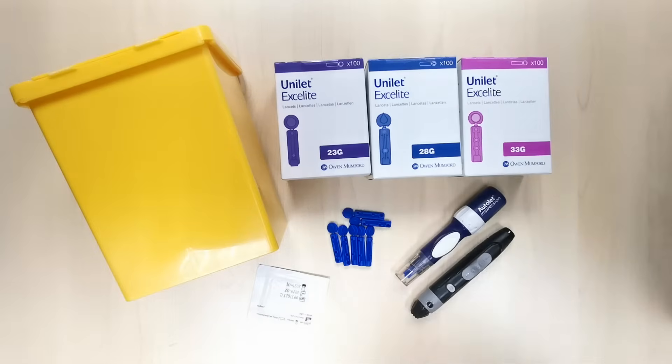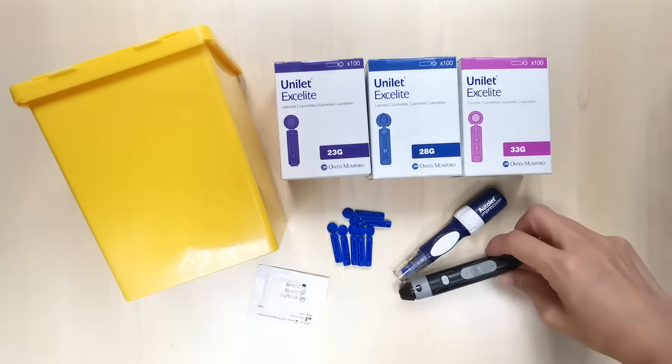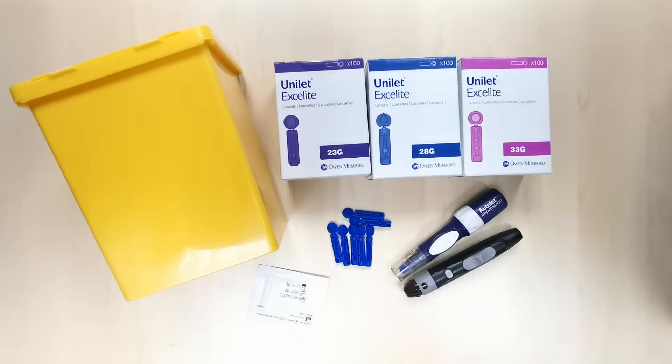Before you begin your finger pricking, you will need a box of lancets — this is the Unilet Excelite — a lancing device — this is the Autolet Plus — an alcohol swab, and a sharps container.